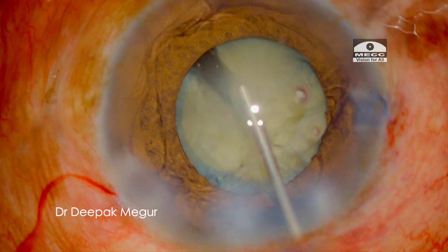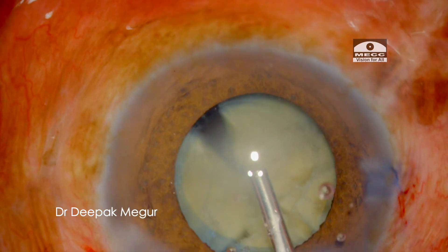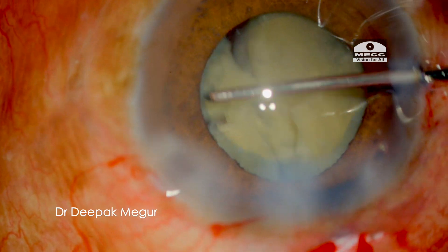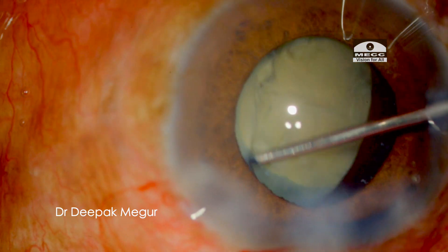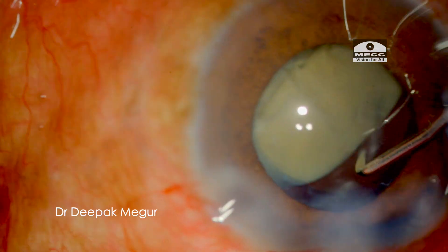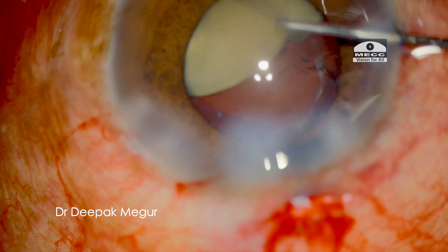All the quadrants are free on the upper side but they appear to be attached at a common point at the posterior plate. Trying to mechanically separate the posterior plate in the bag by repeating the lateral separation may not be a good idea, since we are dealing with a potentially loose bag and zonules in this case.